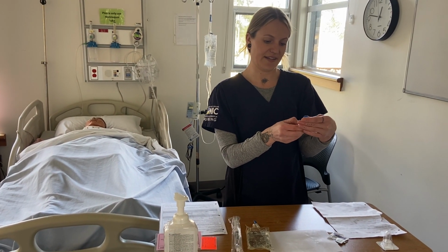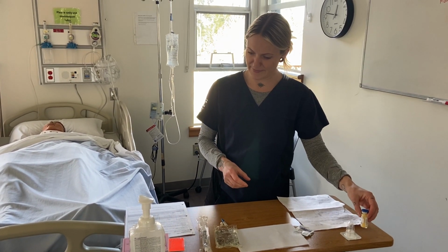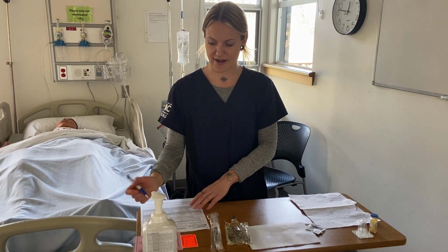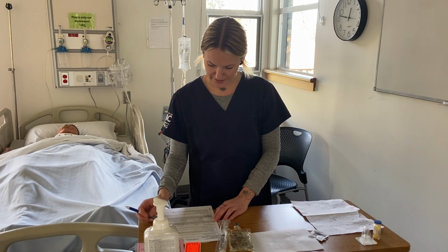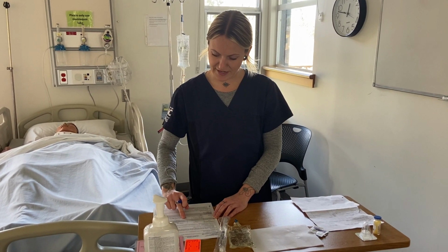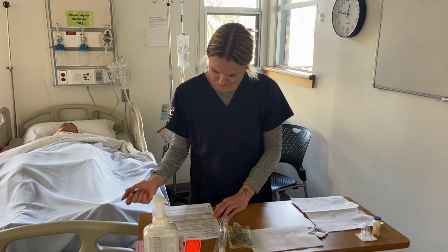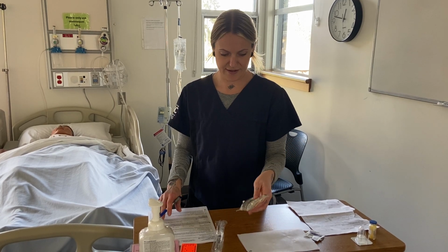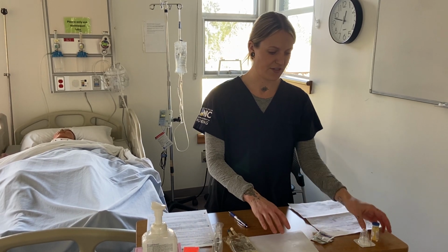My first check, it's not expired till 2025, so that is good. The next thing I will do is just check with my IV monograph what it's compatible with and how much I need to dilute it with. So I've got 1 gram, and I know for intermittent infusion, I need to dilute it in a 50 to 100 ml mini bag, compatible with normal saline, which is what I have here. So that is good. And so the next thing I can do is just prepare my medication.